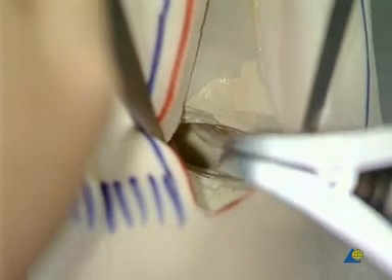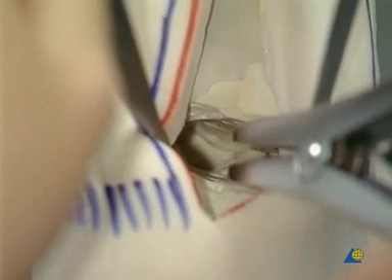Deep within the joint, the articular surface of the navicular bone can be seen, as well as the talar head. A bone spreader is placed at the lateral edge of the subtalar space for over-distraction.